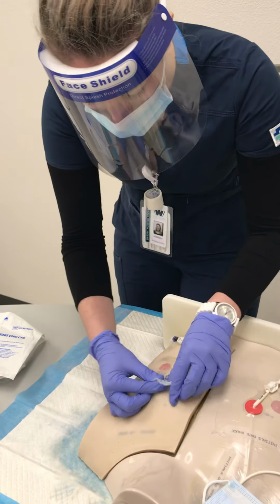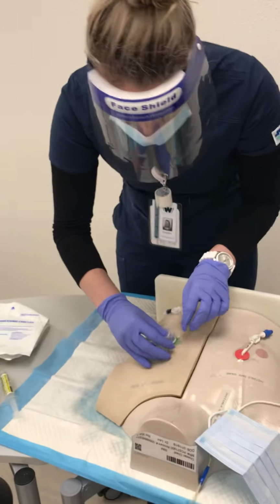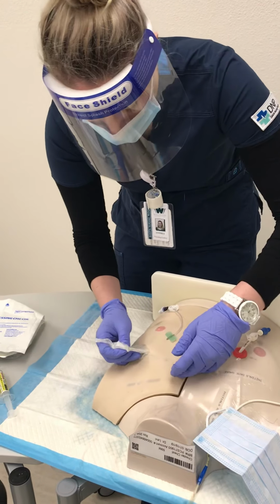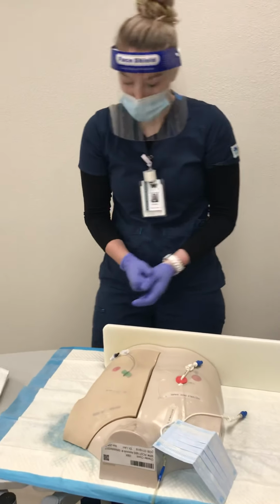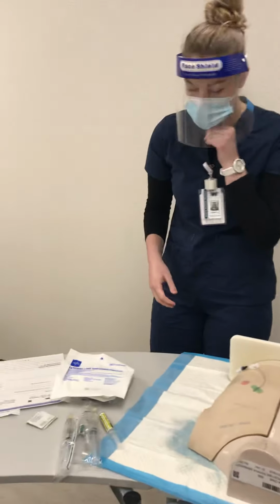And again, their mask is on and their head is turned away, and I have a mask on myself already. Okay, so careful not to touch the insertion site, and then this can be discarded, as well as my gloves. And I'll perform hand hygiene again, and then I'm going to become sterile.